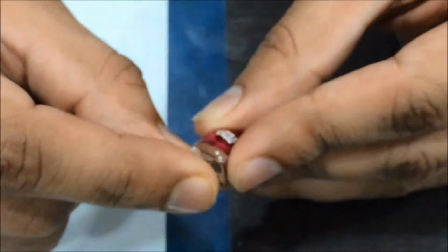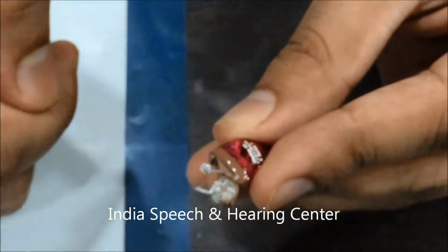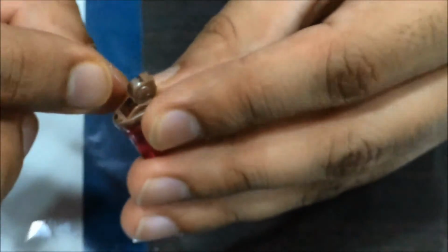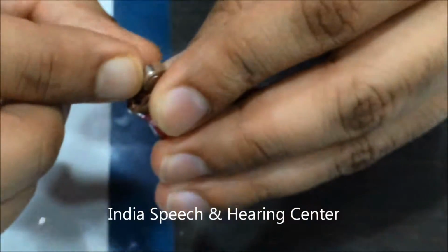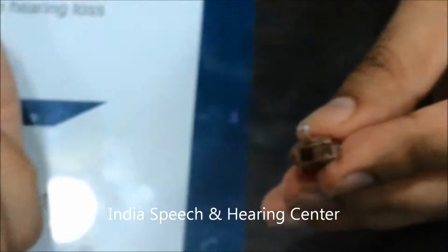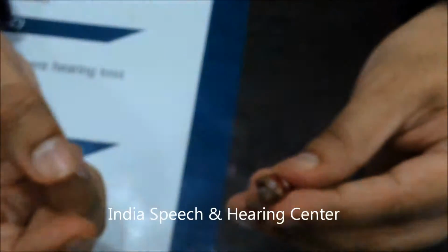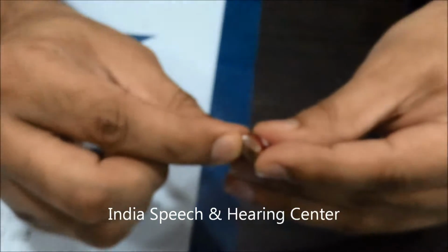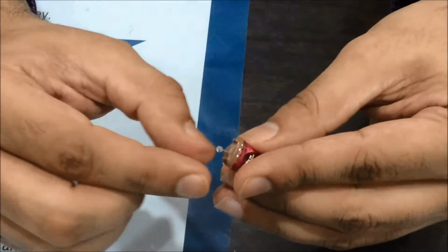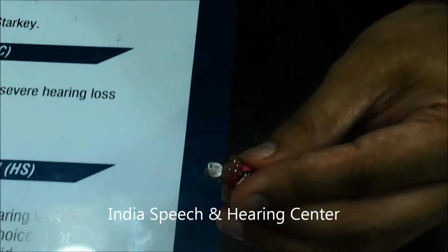If you see, I'm doing this. This is how you insert the battery. To remove the battery, you can just use your nail again and pull the battery out. As soon as you close the battery door, the hearing aid starts functioning. Whenever it is not in use, you keep the battery door open so as to avoid any wastage of the hearing aid battery.